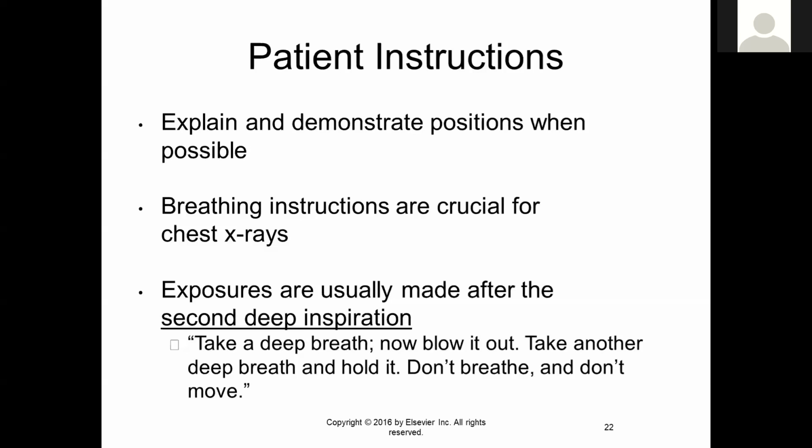So second deep inspiration. You want to be very clear and not rush things. You don't want to say, take a breath, blow it out, take another breath. Let them breathe in and out. But you don't want them breathing while you take the X-ray. So they're going to hold their breath, telling them don't breathe, don't move. If they're holding their breath but moving around, you're going to get a blurry picture. So be very clear in your instructions.